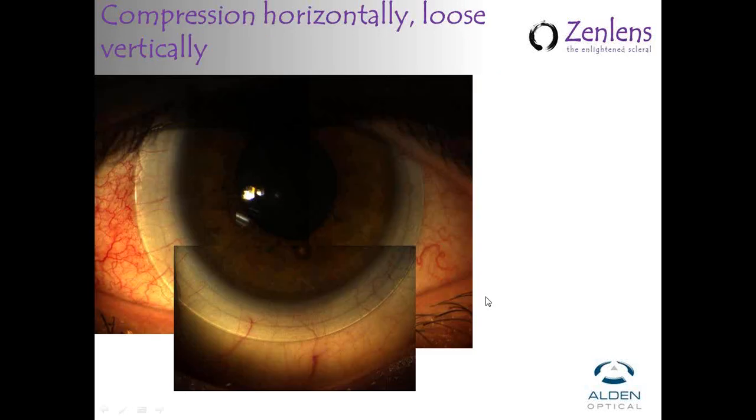John, can you go back to the left slide? Can you take your cursor and put it at the inferior view there? And the vessel on the left side, the real bold vessel that comes through, can you see how there's just a little bit of deflection of that vessel as it hits the edge of the lens? You see it shift? That's a good indication that that edge is a little bit loose. It's probably lifting away from the eye just slightly, and that's causing that deflection in the course of the vessel. It's an optical thing. It's not a true movement of the vessel, but with that lens lifting off, the optics of the lens cause a shift in the visual of that vessel, and that's another way to look and see if a lens is a little bit loose.